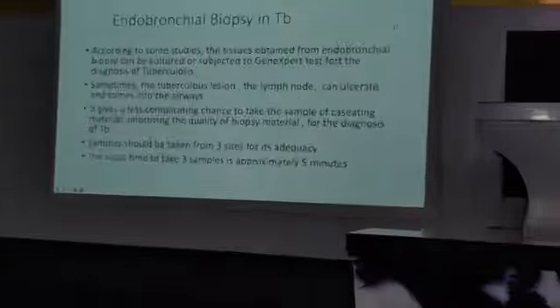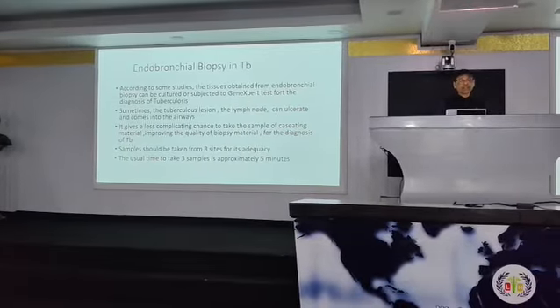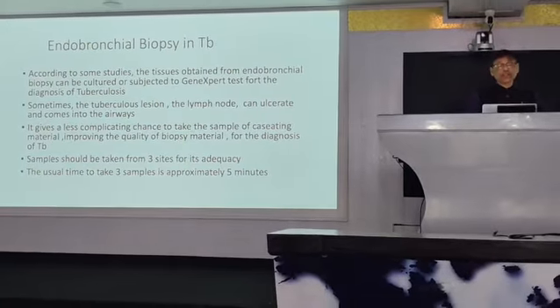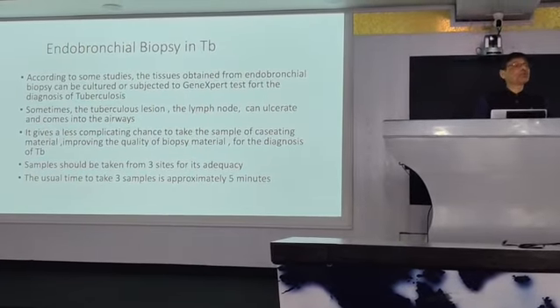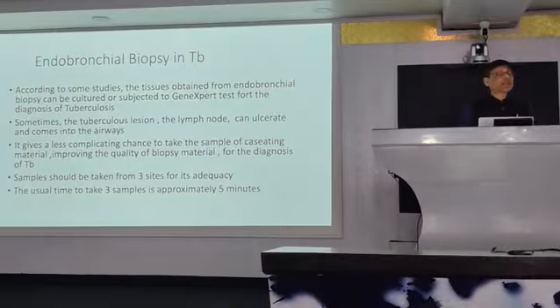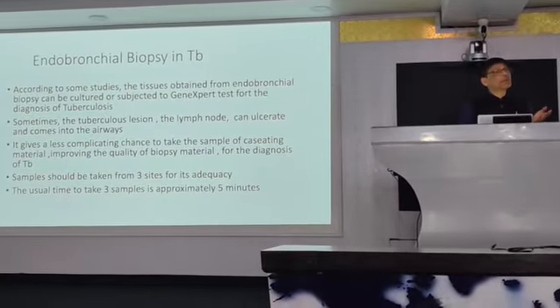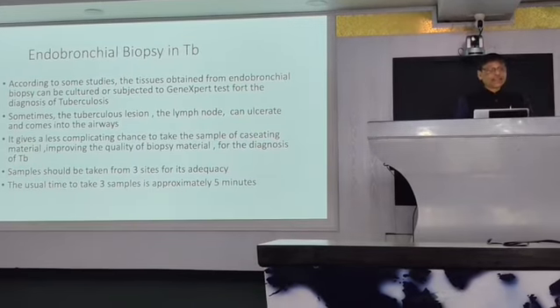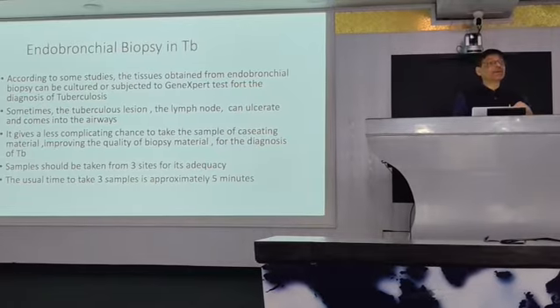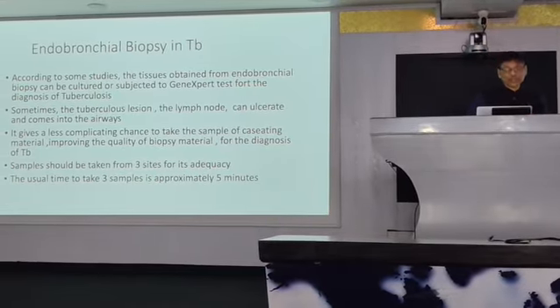Endobronchial biopsy in tuberculosis. According to some studies, the tissues obtained from endobronchial biopsy can be cultured or subjected to Gene Xpert test for the diagnosis of tuberculosis. Sometimes we take a BAL sample and subject it to Gene Xpert test and it comes negative. But if you take this endobronchial biopsy and then do Gene Xpert with this sample, then it may come positive. So this is useful.